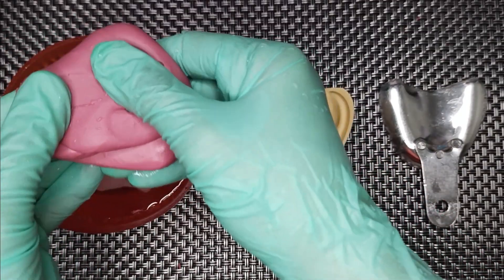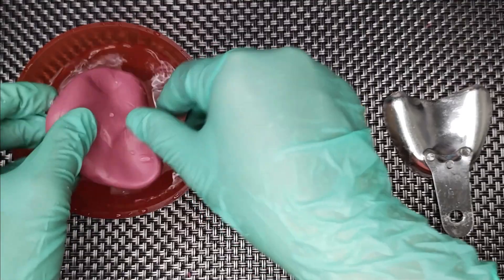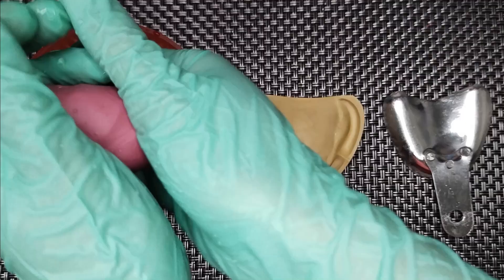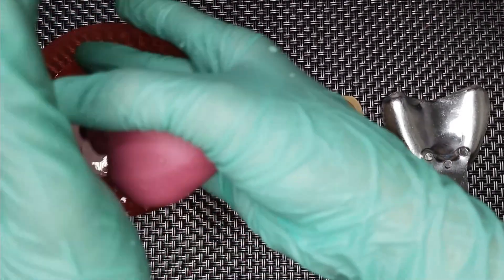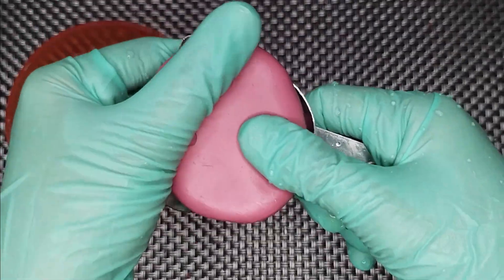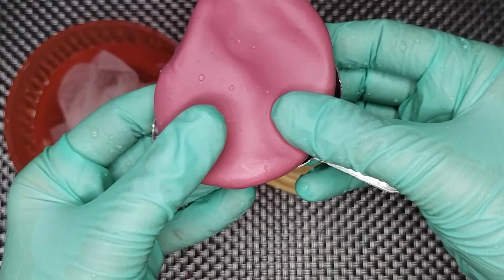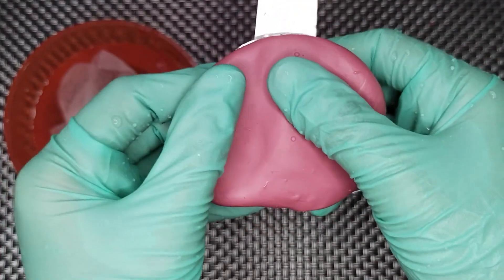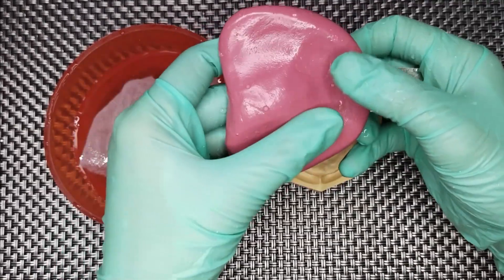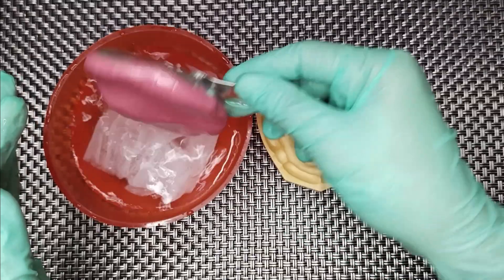Knead the material between your fingertips until it is completely softened to a plastic state. Once completely softened, form it into a ball between your palms and then slowly load it in the tray. Start at the center of the tray and mold it to the edges to avoid incorporation of air bubbles or creasing of the impression surface. Make indentations on the surface of the impression to accommodate the shape of the arch. Heat the material again before introducing it on the model.